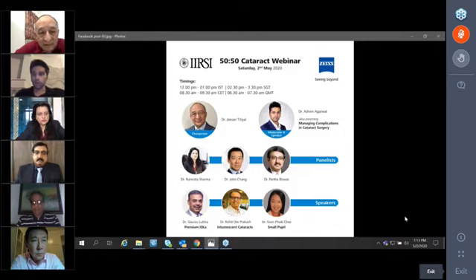Fantastic, thank you. Dr. John, would you want to comment on this? Yes, I'm also more conservative. I probably would take the whole complex out as well and do a glued fixation of an IOL. In this situation, you can even glue a multifocal 3-piece IOL.